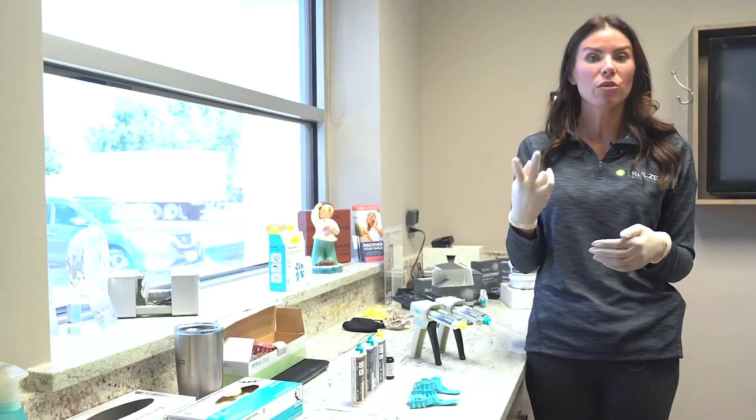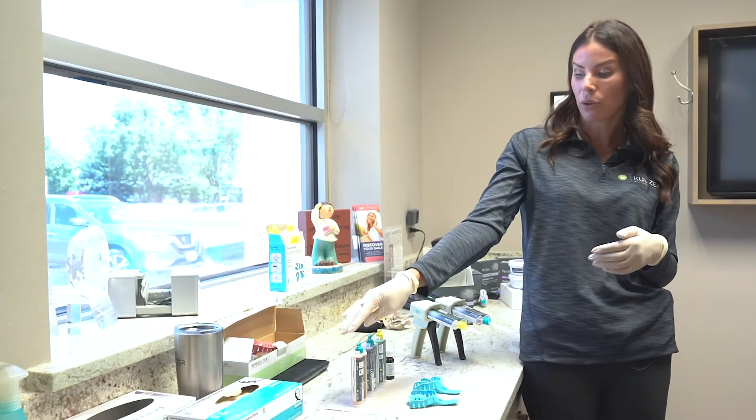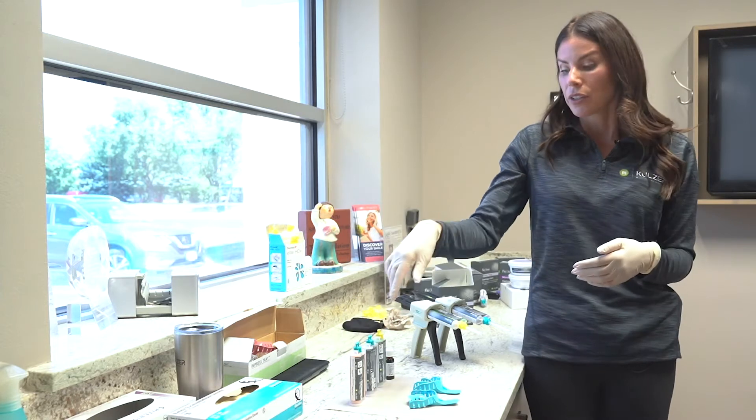Today we are going to do two types of impressions: one for crown and bridge, and one for a night guard or mouth guard.